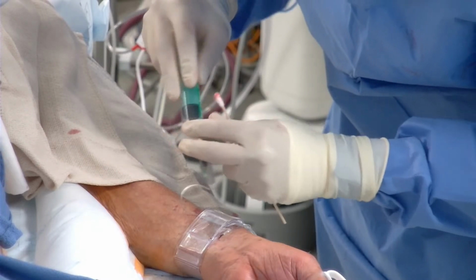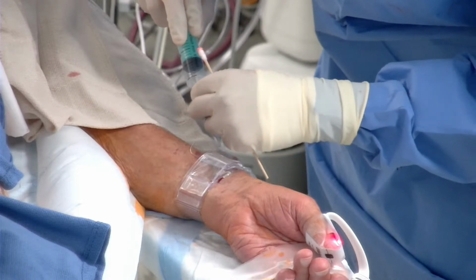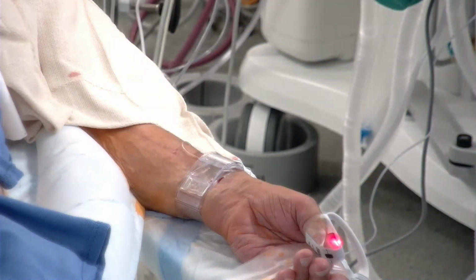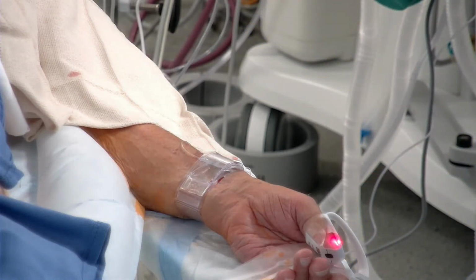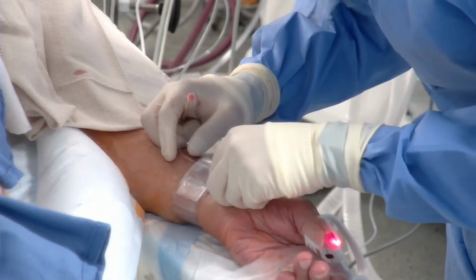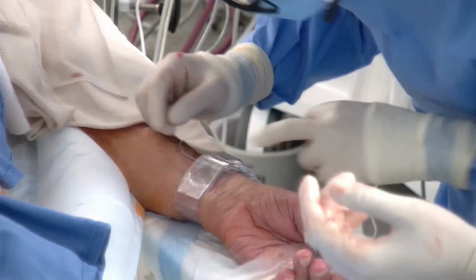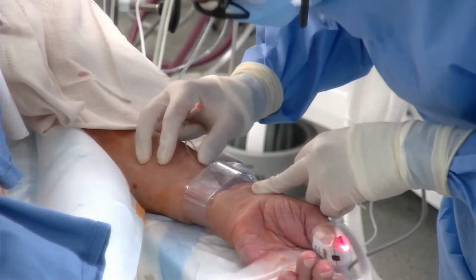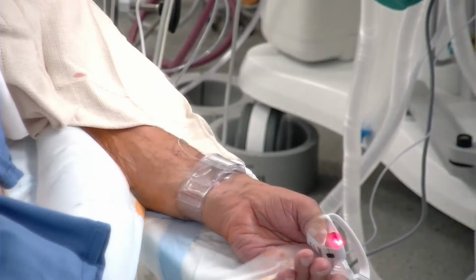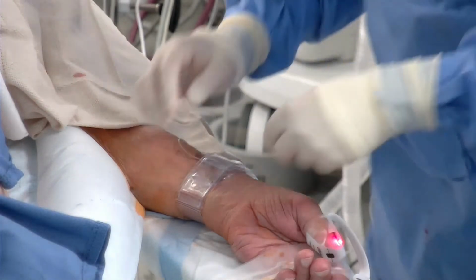I like that technique, because that's always kind of annoying. There's a bit of blood there, and I don't know. Right, so that little Q-tip. So we got about 14 cc's of air in there. For patients on apixaban, it may take a little bit longer. I tell patients, especially if they're on a blood thinner, have low platelets, or a high INR, they almost invariably end up with a bruise. But the only time we really worry about the bruise is if it goes up above the elbow. And I'll be honest, we've been doing this for a long time. I've never actually seen it go above the elbow, so that's okay.